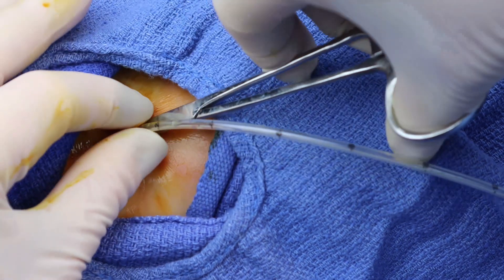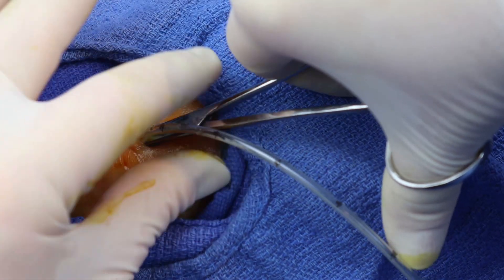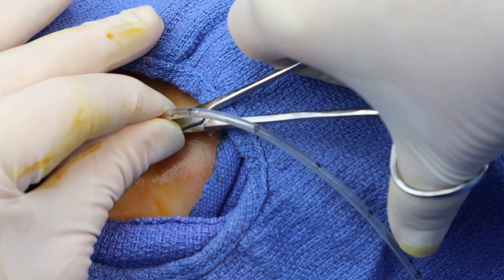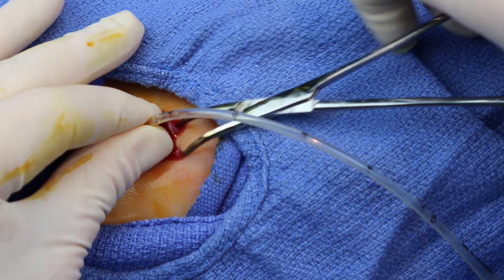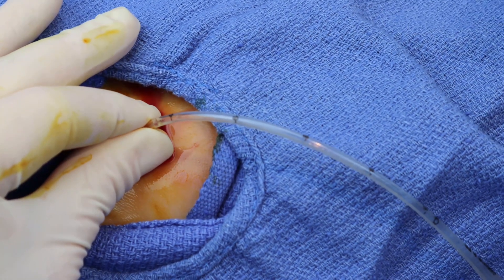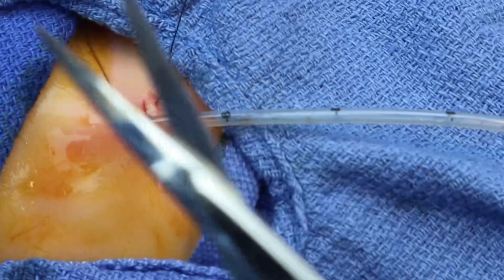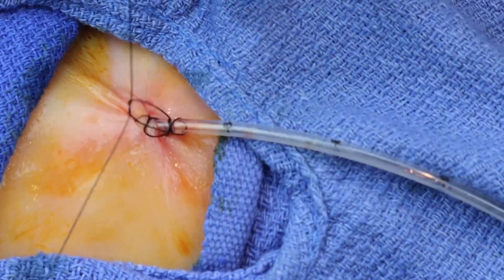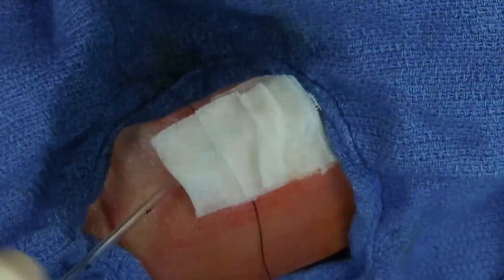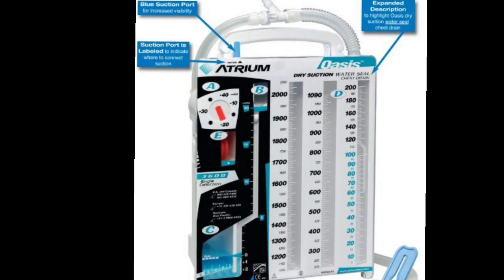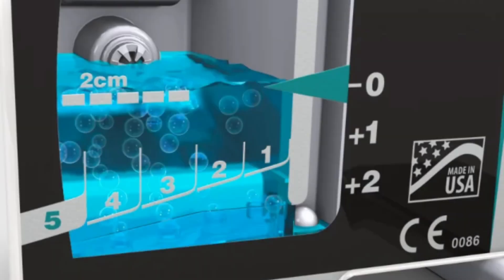Immediately stop advancing the hemostats when there is a loss of resistance. You can then open the hemostats and begin advancing the chest tube. You may stop advancing the chest tube when you've inserted it at least 2 to 4 centimeters, depending on the patient's size. You will next take your suture, making a purse string around the end of the tube, and ensuring that the tube is sutured securely in place. You can then cleanse the area of betadine and place your Vaseline gauze. You will then connect the end of your chest tube to the atrium water seal, ensuring that there's bubbling in the water seal.